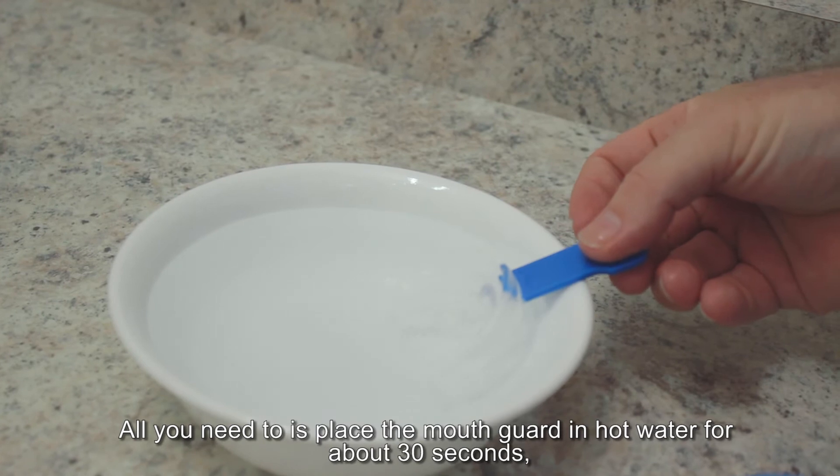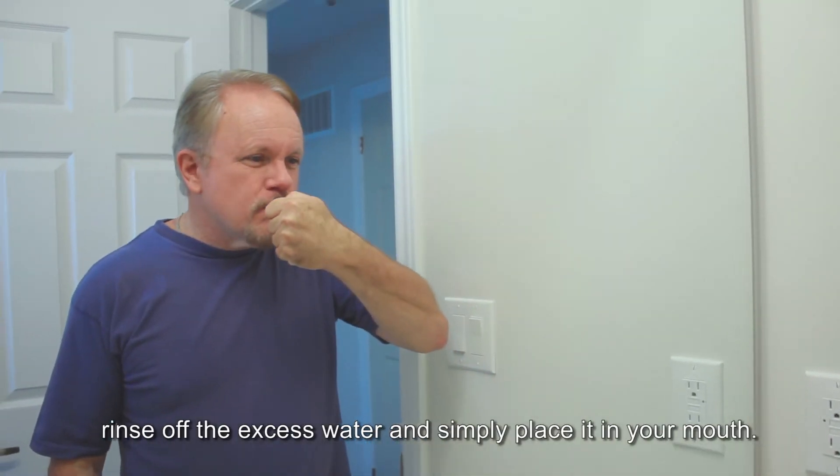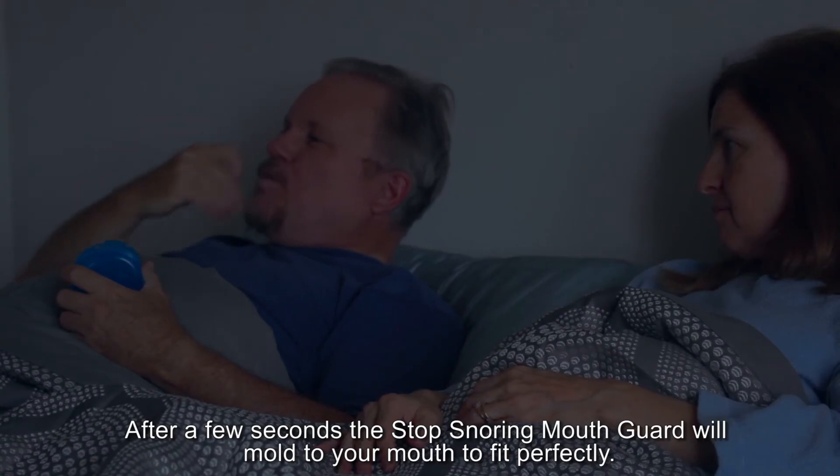All you need to do is place the mouth guard in hot water for about 30 seconds. Rinse off the excess water and simply place it in your mouth. After a few seconds, the Stop Snoring Mouth Guard will mold to your mouth to fit perfectly.